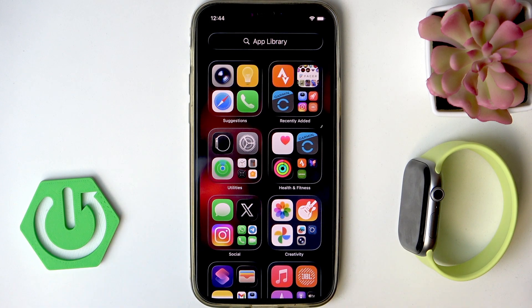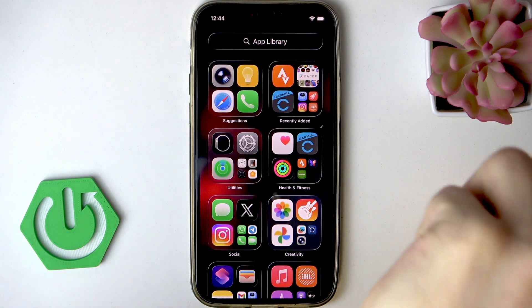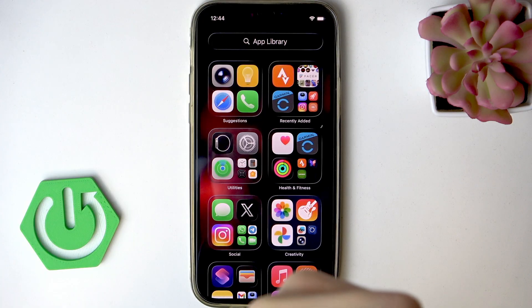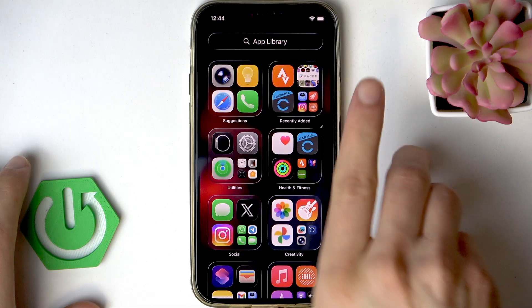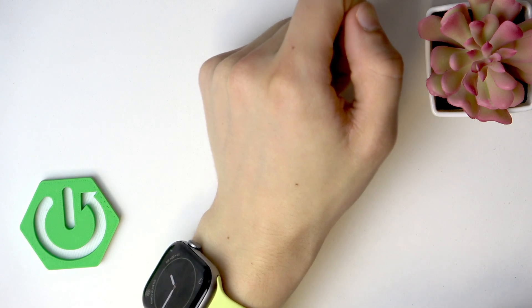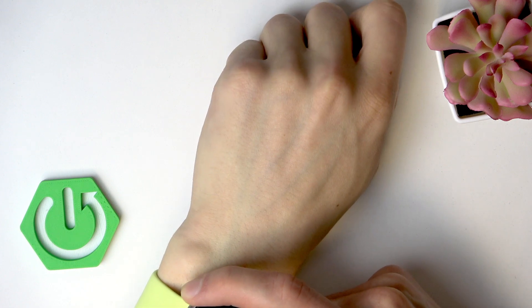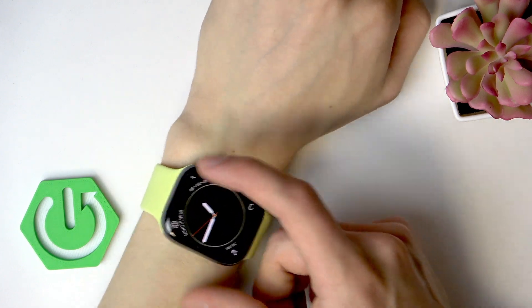First of all, you have to wear your Apple Watch on the wrist on which it's supposed to be worn. Make sure your Apple Watch is worn snugly on your wrist. Then clean and dry the watch if you were showering, swimming, or washing your hands before starting this measurement.